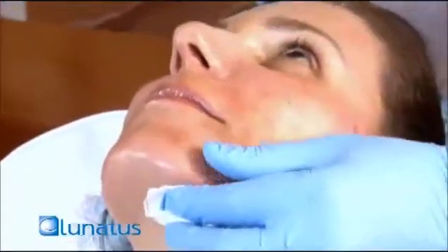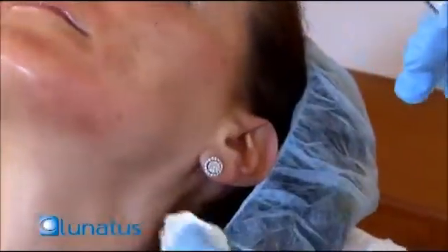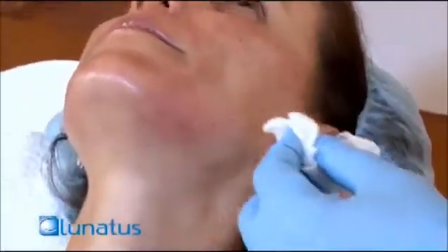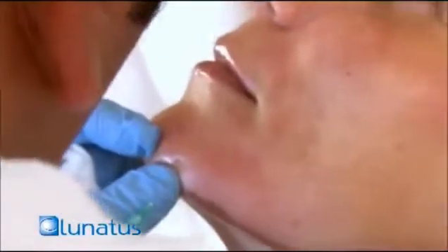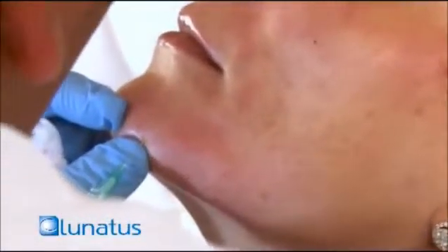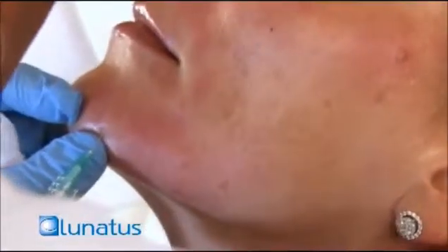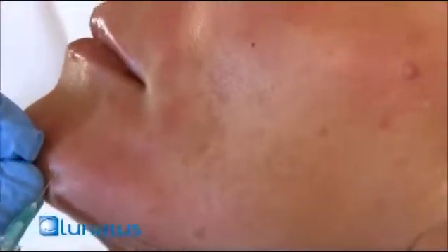I find she's going to need a little bit more, so I'm injecting a little more on the left side compared to the right. Some people have asymmetries, and it's very important to know that you don't want to say 'I injected 0.5ml here so I have to inject 0.5ml there.' No — you inject as much as needed to provide you with the best aesthetic outcome in the end.